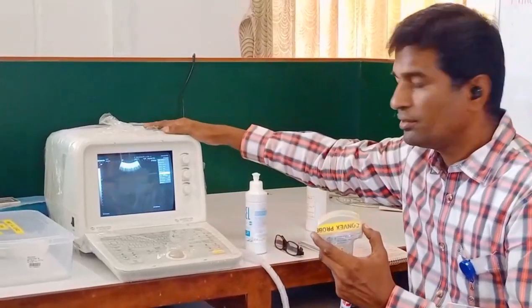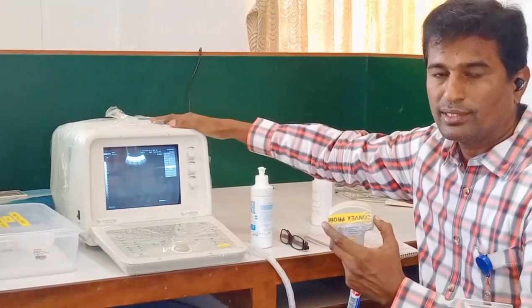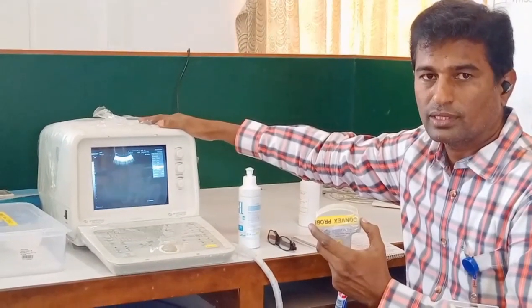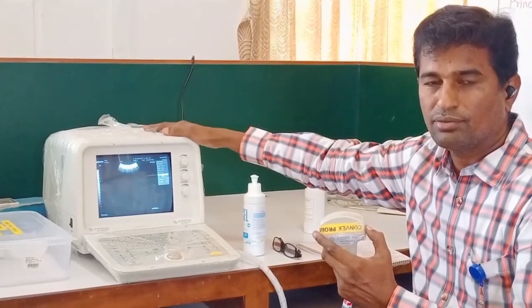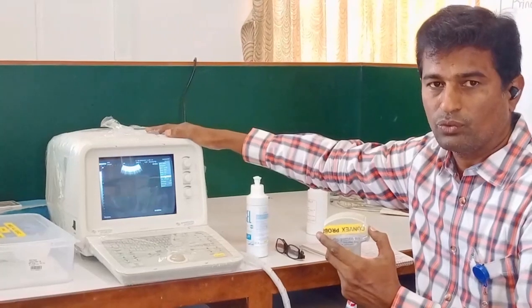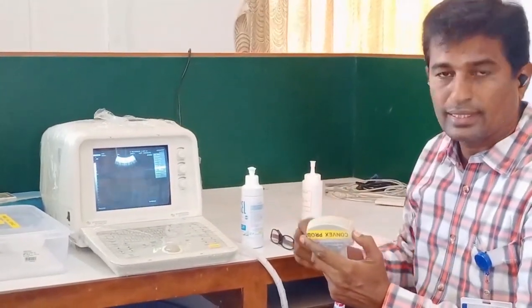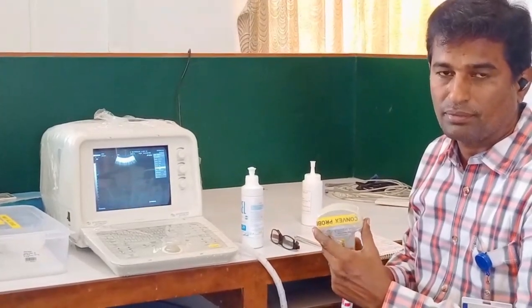And we will have the high frequency transformer and the transducer. So when this pulse generator gives a pulse to that transducer, the crystal gets a deformation, which converts that electrical signal into high frequency sound waves. So now we are going to test the heartbeat of a patient.